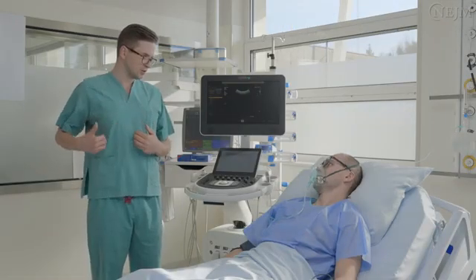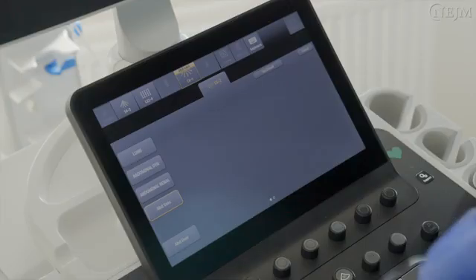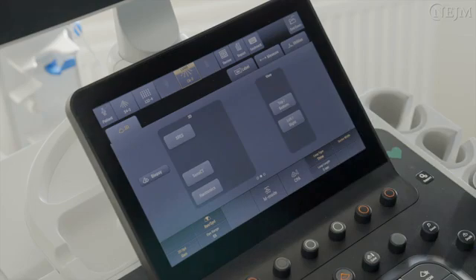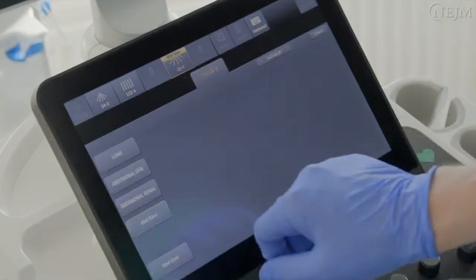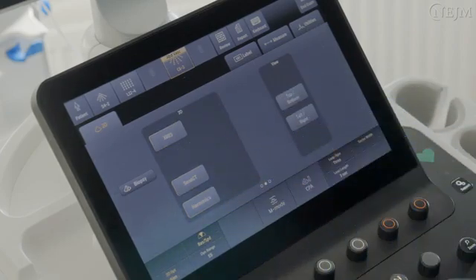Place the patient in a semi-recumbent, supine, or prone position. If the patient is able to follow instructions, the examination may be performed with the patient seated upright. Select the lung preset setting on the ultrasound device, which will adjust the gain, depth, and focus to the levels used most commonly in lung ultrasonography. If this setting is not available, disable the image enhancement filters such as cross-field imaging, noise reduction, and harmonic imaging. These filters can reduce or modify artifacts and thus make image interpretation more difficult.